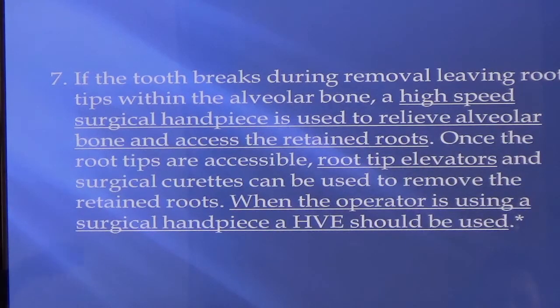Okay, anytime when we're just elevating, if we're just using our elevator, you're using the small tip, the surgical tip, basically to suck away on the blood so we can see where we're putting the pressure.